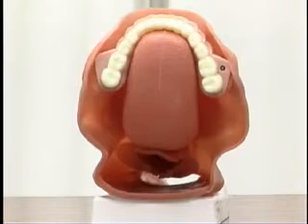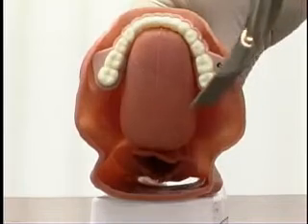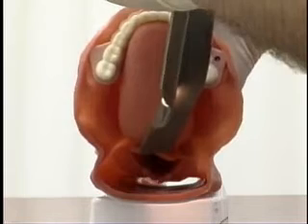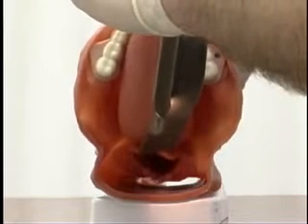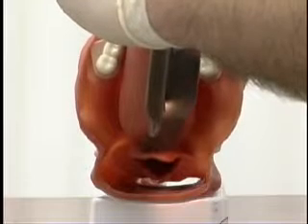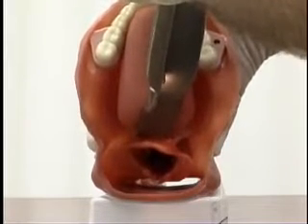I'm going to talk to you about the blade placement. You have two types of blades. The first one is the Macintosh blade. No matter what size of Macintosh blade you have, the placement of the blade is the same. Basically, this blade is going to go down the base of the tongue on the right-hand side, and the blade is going to fit right between the epiglottis and the base of the tongue — that's the vallecula. Then when you pull straight up, you're actually visualizing the vocal cords.